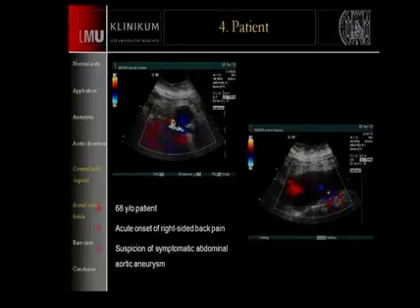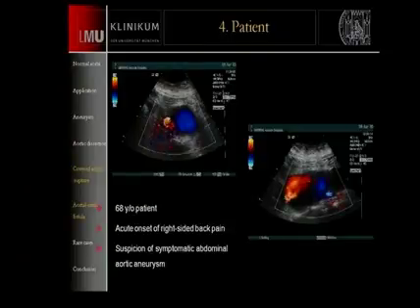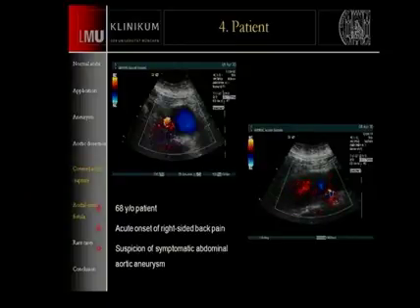But could we see this fistula? It must be somewhere here. Also in the longitudinal view, we can see that must be here in this area. But how many fistulas exist in this case?